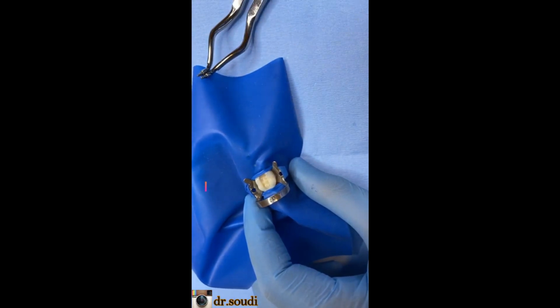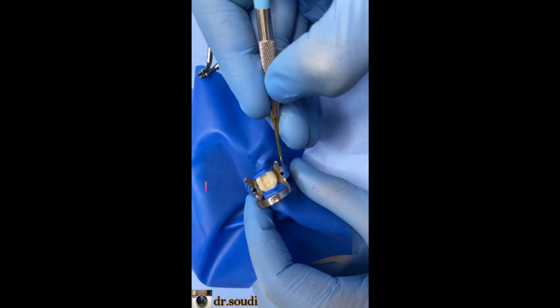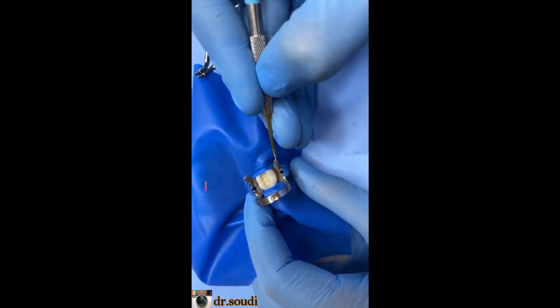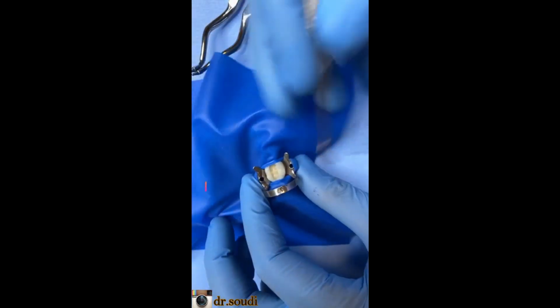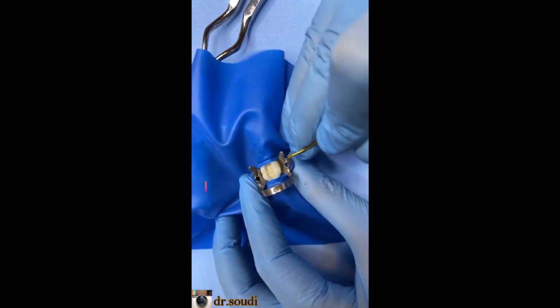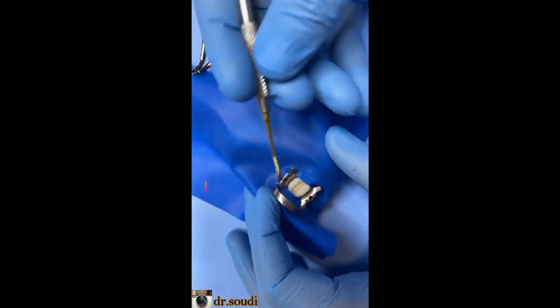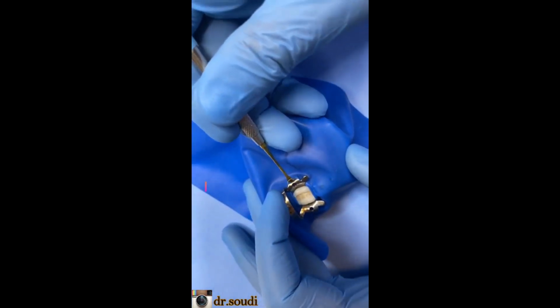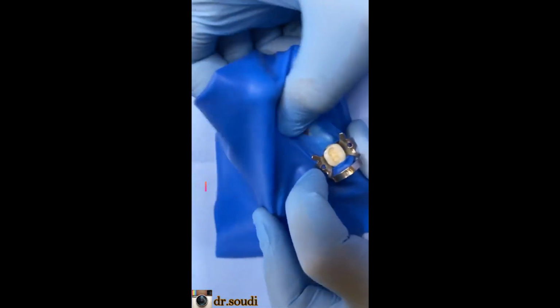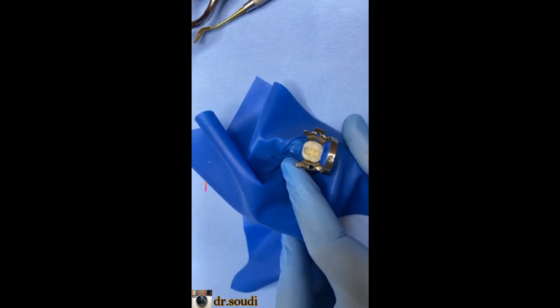Don't use a probe or a sharp instrument. Please don't do this. Just a blunt instrument, and the sheet should slip over the wing like this and like this. Okay, and then you can stretch your sheet to the other teeth.